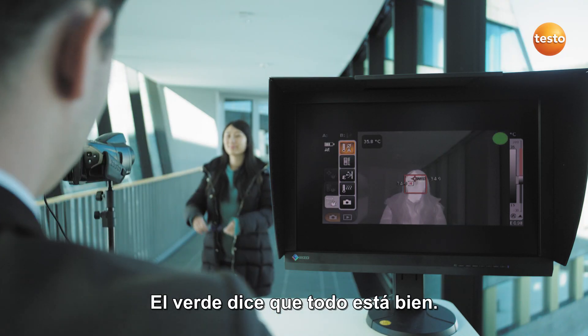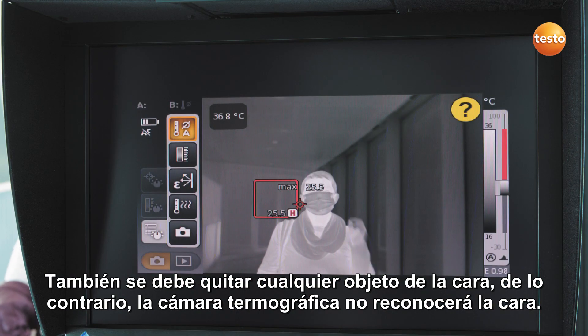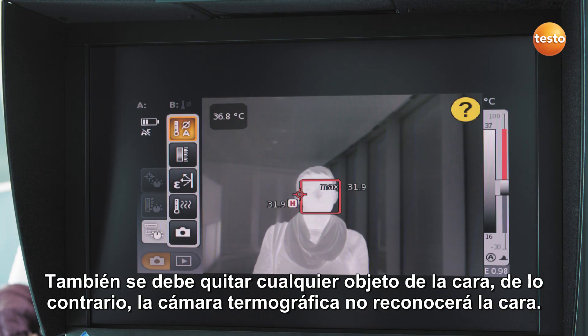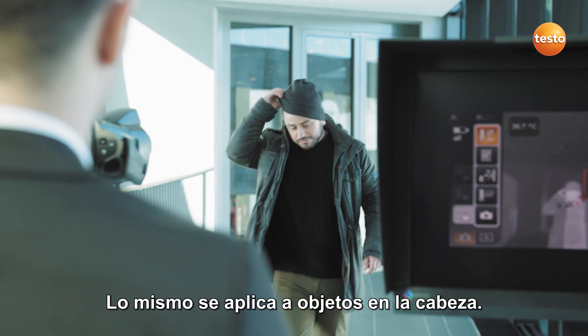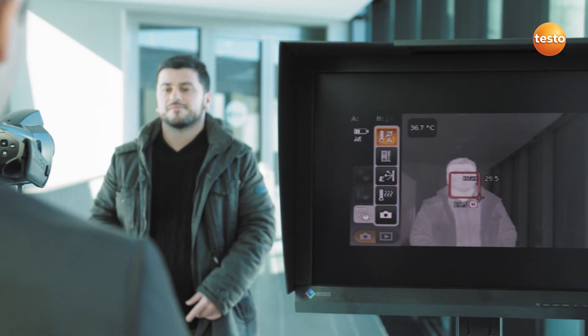Green says everything's okay. Any surgical masks must also be removed, otherwise the thermal imager will not recognize the face. The same applies to head coverings — please remove these also.